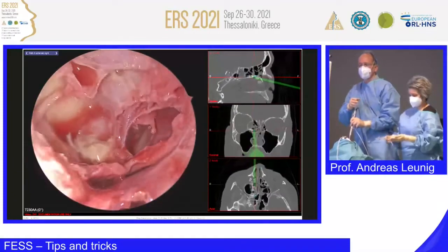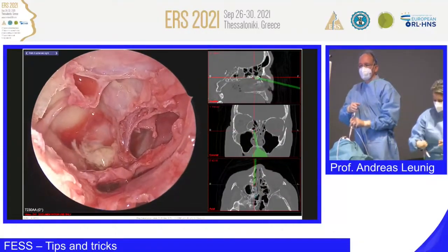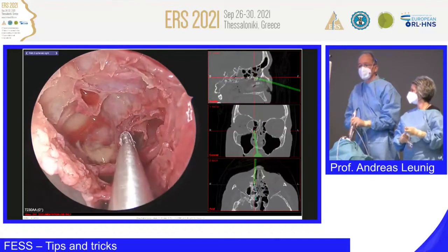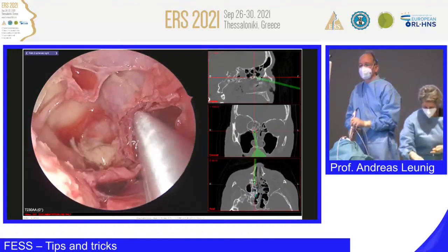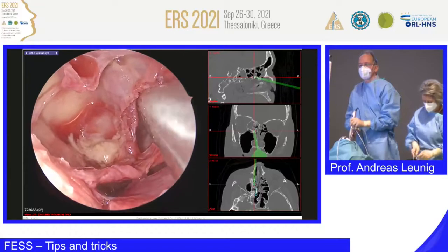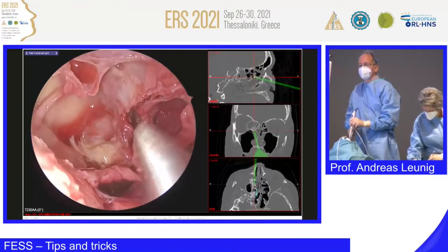So please, the elegant punch. I do a little bit more, and then maybe we can have a look inside this. Yes, the big one would almost be preferable. We'll see. Yeah, you're right. You see, Katharina is right. She gave me the right instrument. This happens quite often, so after a while they get very experienced.